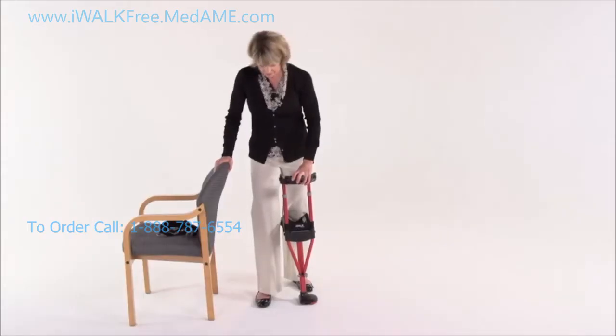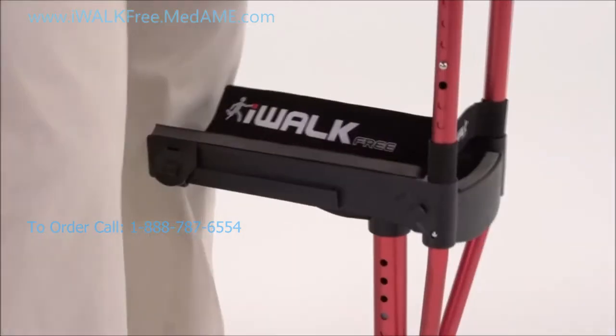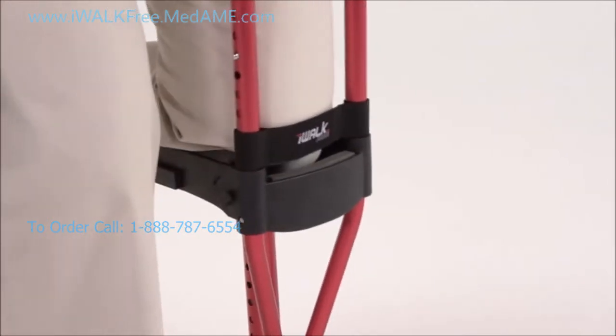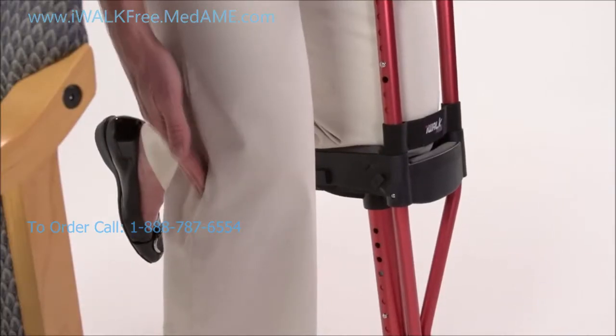Place the foot of your iWalk directly beside your good foot, about shoulder width apart. Now grab the handle and slip your knee all the way to the front of the platform. If the platform height is correct, you'll have about a 5 to 10 degree bend in your good knee.